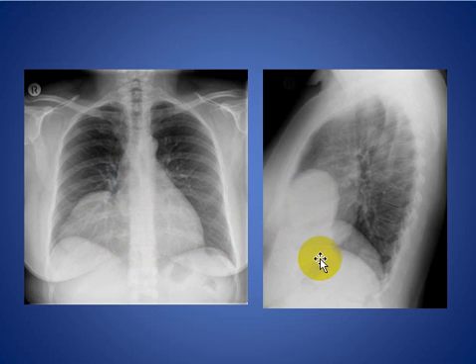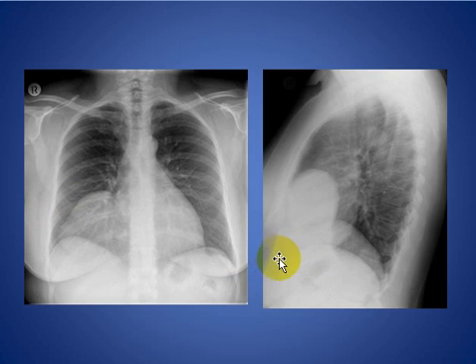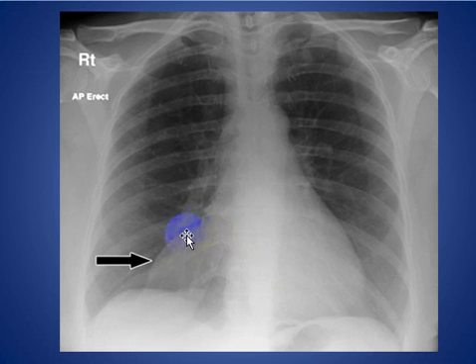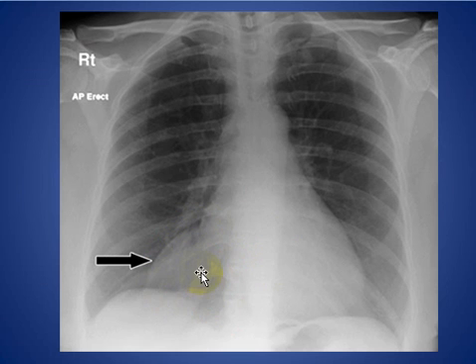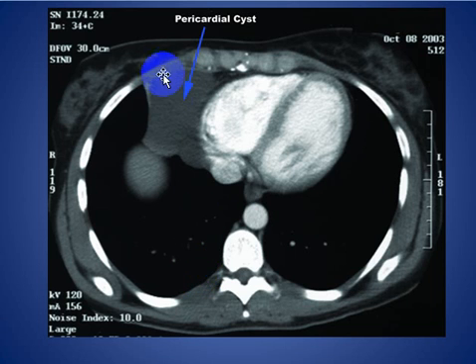Here is another right cardiophrenic mass silhouetting the right cardiac border, indicating an anteriorly located anterior mediastinal mass. And here is the CT scan of the patient showing a pericardial cyst.